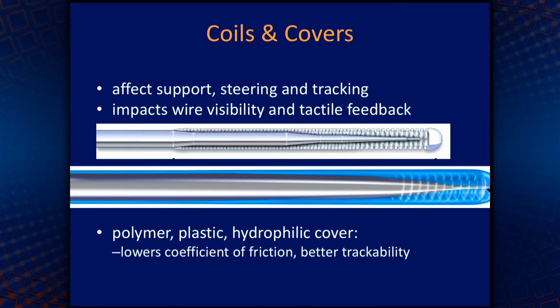What about coils and covers? Well, coils will affect support, steerability, and trackability. It impacts the visibility and the tactile feedback, while the covers, which may be polymer, plastic, or hydrophilic or hydrophobic cover, will decrease the coefficient of friction and improve the trackability.